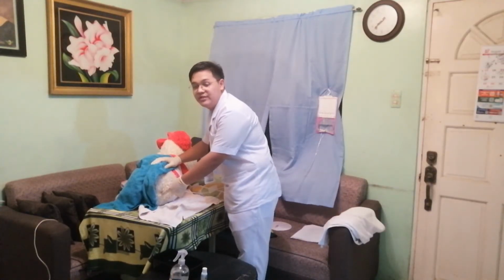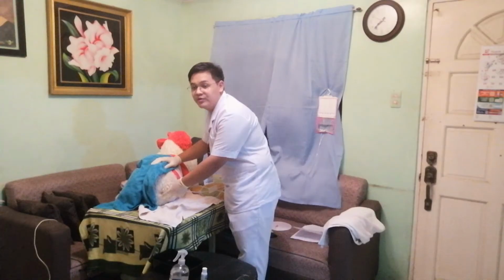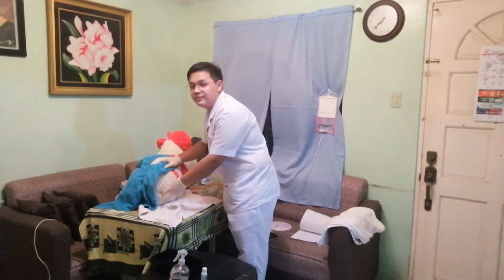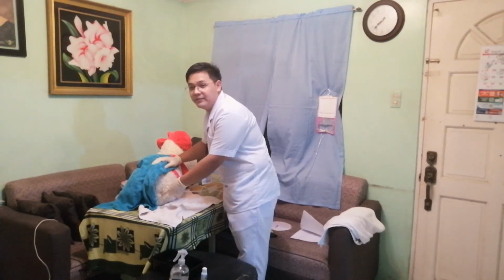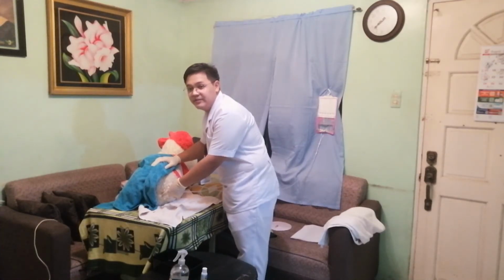To do that, we will need to raise the solution container and open the clamp to allow fluid flow. Or if we are using the enema bottle, we will need to compress the pliable container by hand. Remember, if we are administering a low enema, we need to hang or hold the solution container about 30 centimeters or 12 inches away from the rectum.